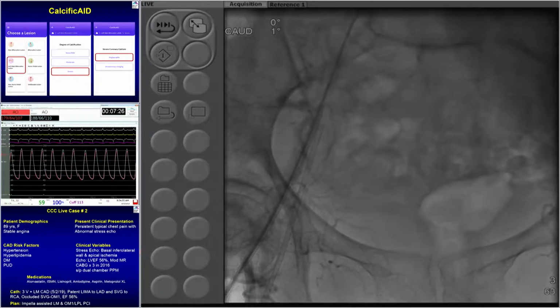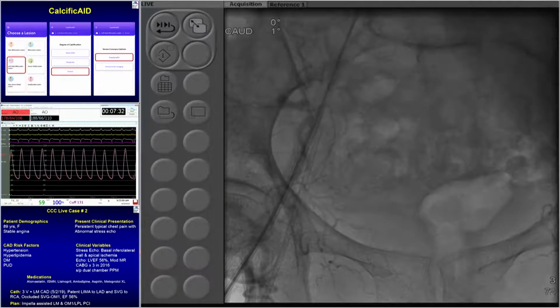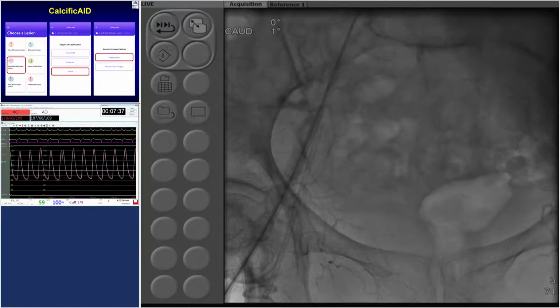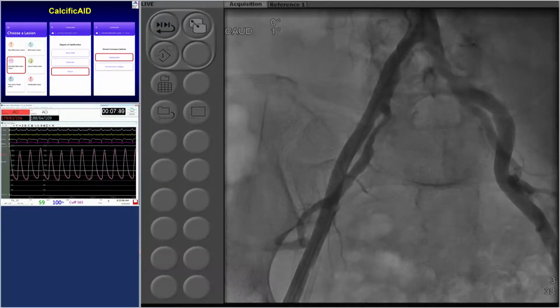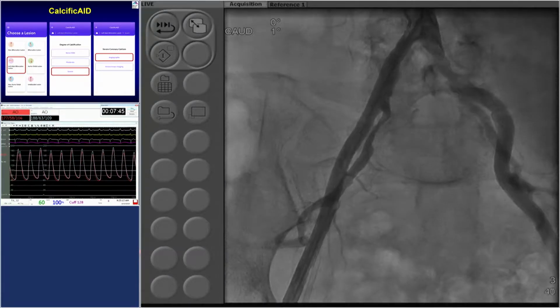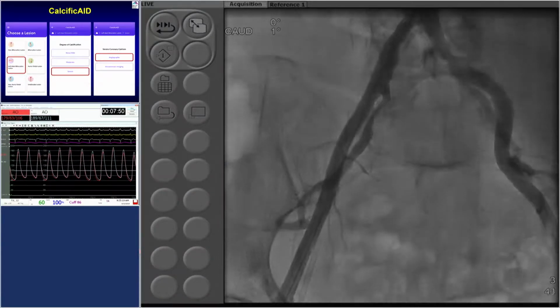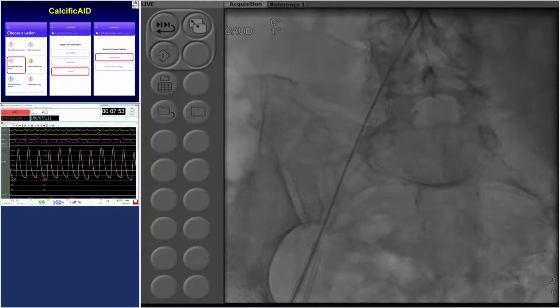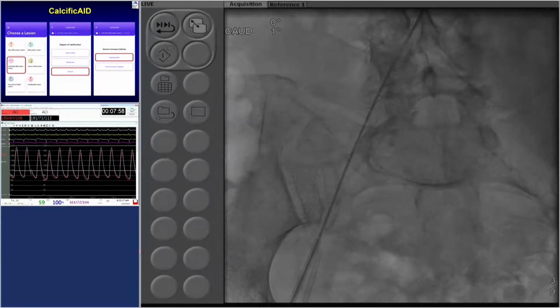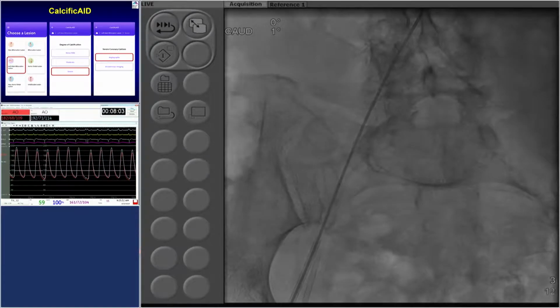I'm seeing a very, very good blood pressure. I see a good EF. I see a patent LIMA to the LAD. I see this is not such a difficult left main intervention for this lab to perform. And I challenge you, just because he's got great legs, he shouldn't be getting support if this is what we're going for. So show me the reason and the evidence why you would actually need support in a case like this, as opposed to the earlier case where there was slow flow, severe calcification, and you guys didn't use any support and did perfectly well.